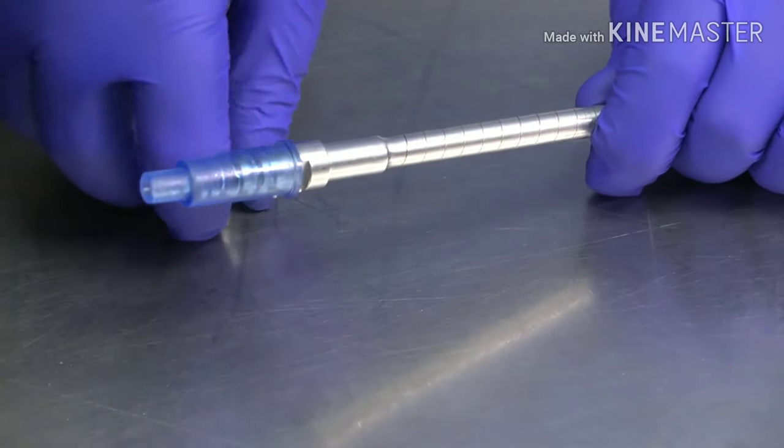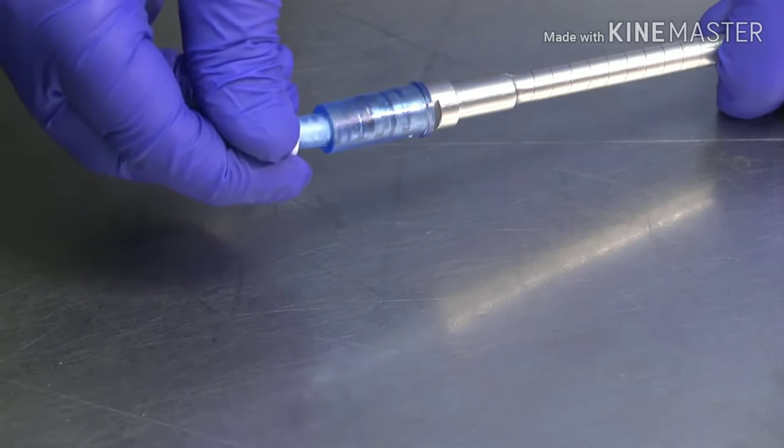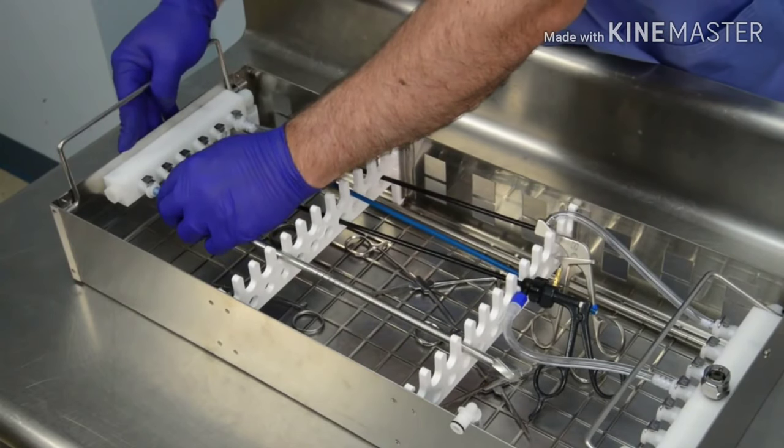Orthopedic instruments such as a flexible bone reamer can be connected by attaching a blue silicone connector to a 2mm nozzle. Place the instrument into an empty slot on the organizer and connect the nozzle to the flush port on the basket manifold.